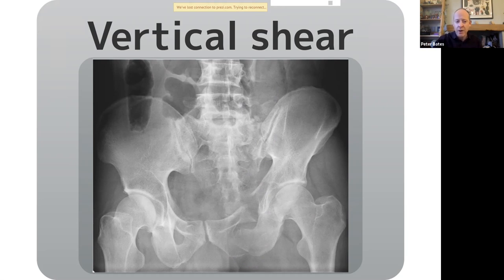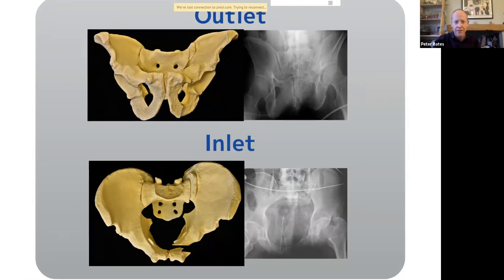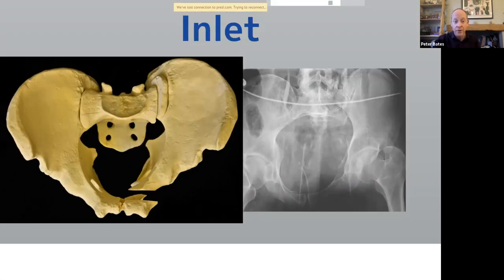But sometimes it's quite hard to work out on a straight AP view like you get in X-ray exactly what's going on. Now, yes, we use CTs, but the classical way of viewing pelvic ring injuries is using inlet and outlet views. I just wanted to show you these, just give you an idea of that. Let's start with the inlet view because it's the most obvious. Here is the fracture running up through the sacral alar right there, okay?